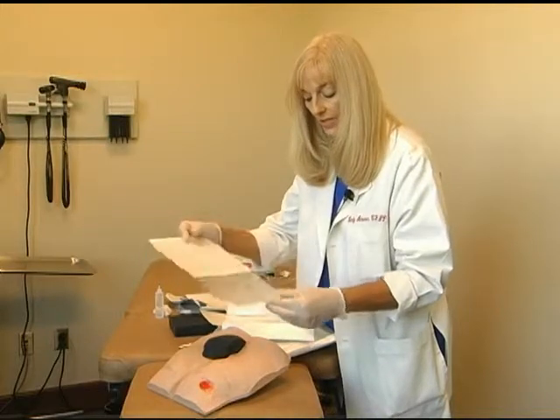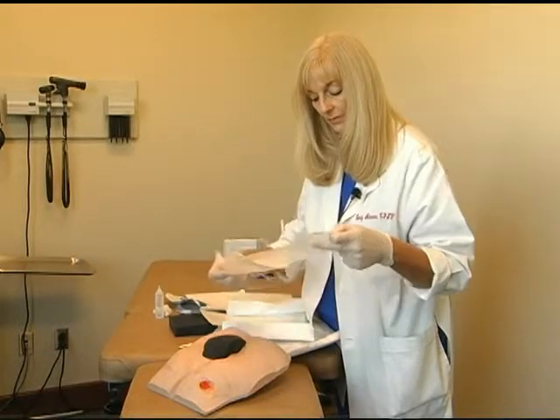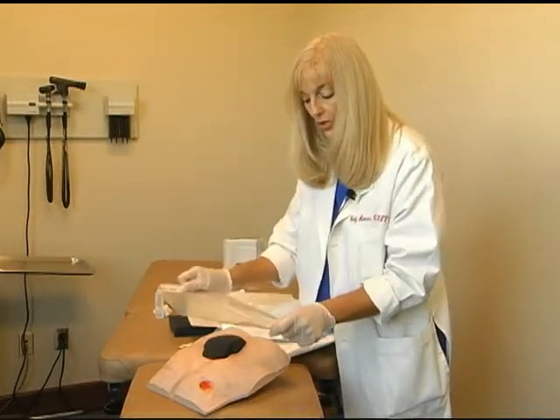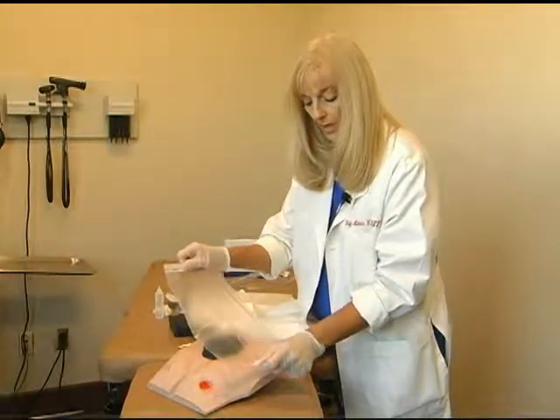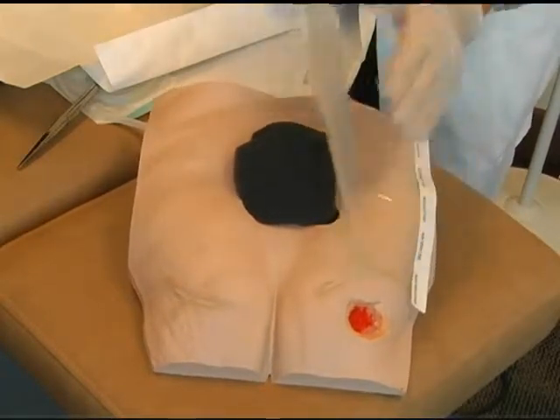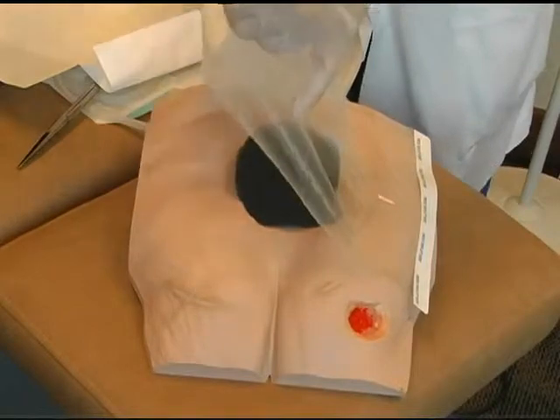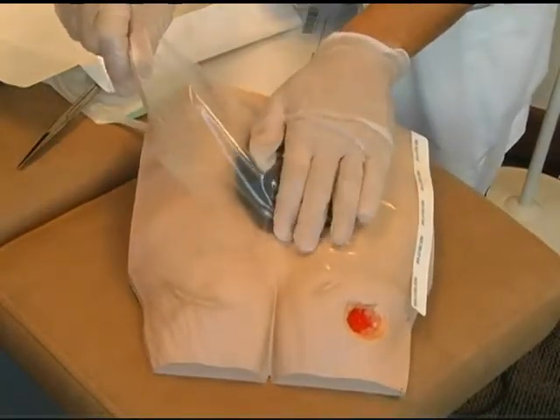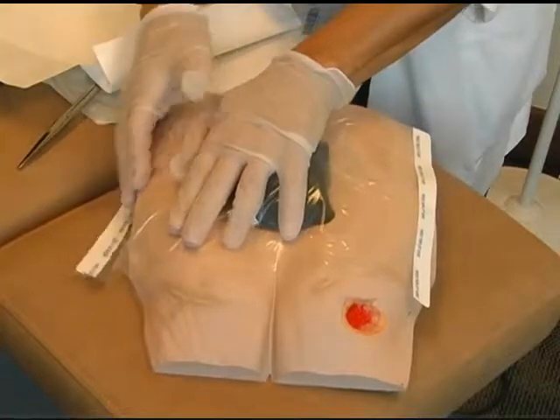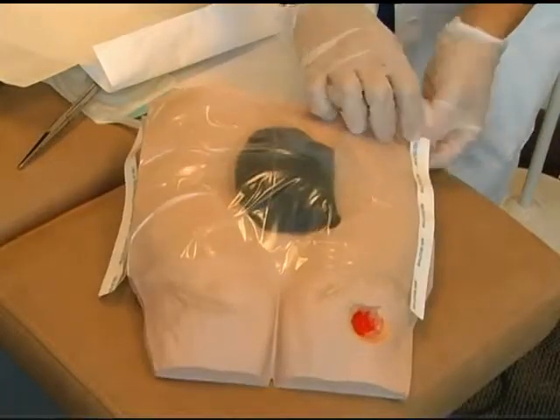You can use only half of the transparency and start your application, or you could pull it all the way off so you can picture exactly where you want to place it. Gently apply your transparency without creating friction over your wound filler. Try to press your grooves first, again not wanting to create extra friction. Then press and peel away the top carrier piece.